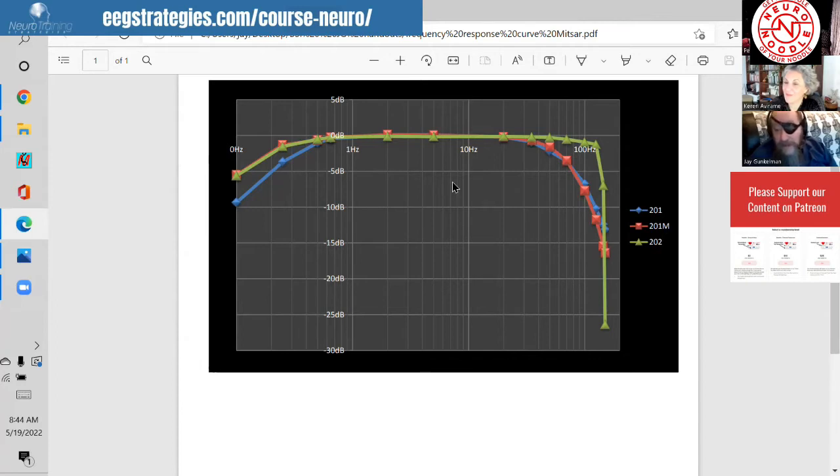That changes a lot. If I have the intention of doing a diagnostic workup on somebody, and I've got an amplifier that's a general wellness amplifier, NeurOptimal is a general wellness amplifier. It's a fabulously good amp. It does a nice job amplifying the EEG. It's linear and all of that.